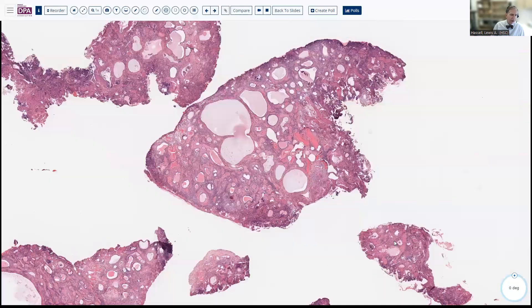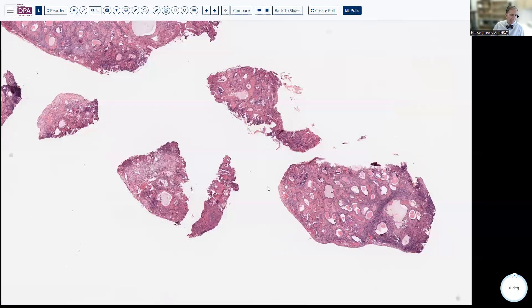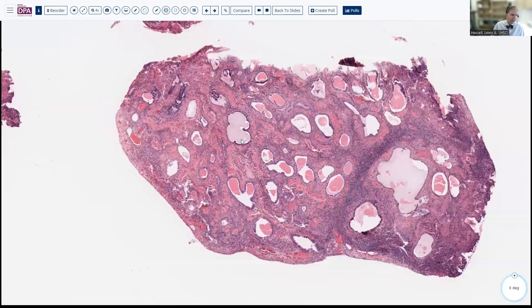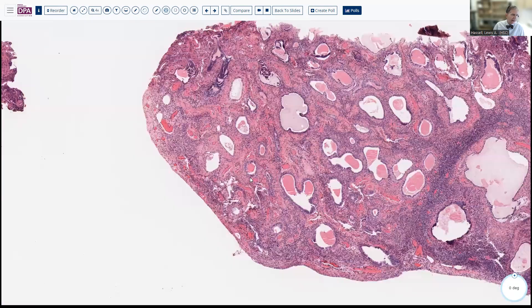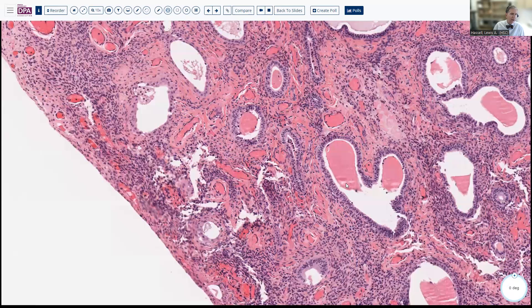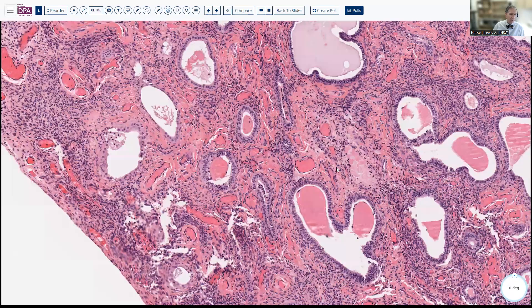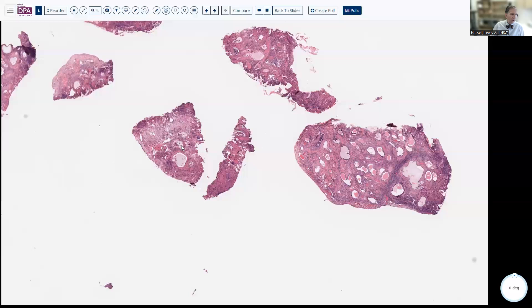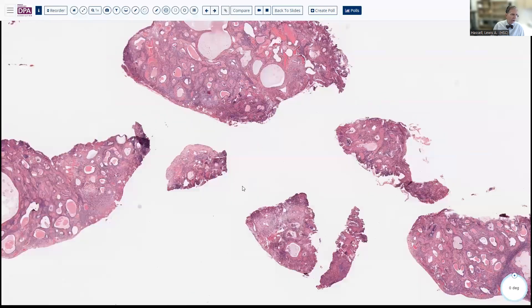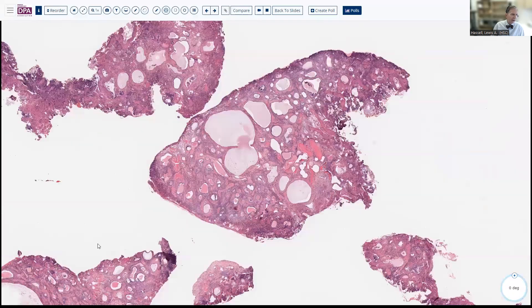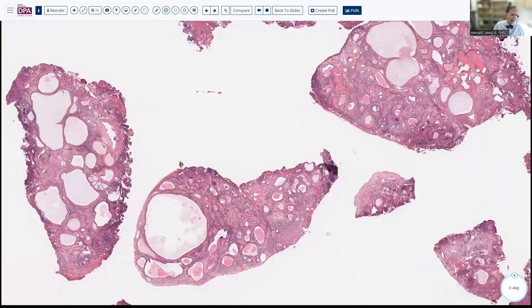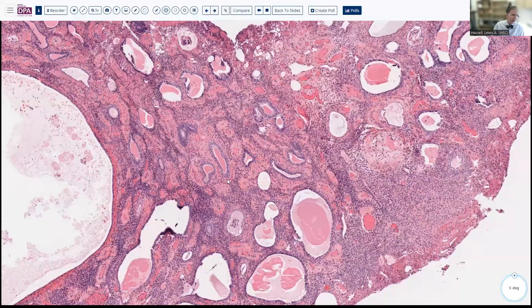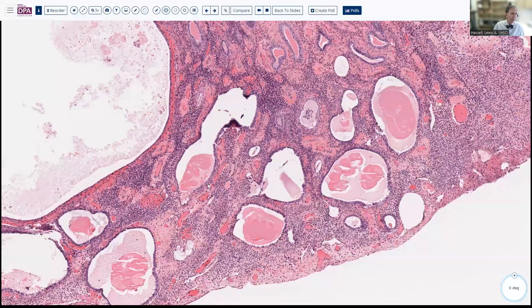Things to rule out include any evidence of epithelial proliferation, particularly any evidence of high-grade nuclear features that can be a marker for serous tumors. Also muscular changes to the stroma, squamous morular formation, and other findings that indicate features not expected in a usual endometrial polyp.